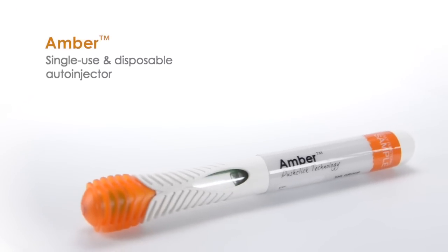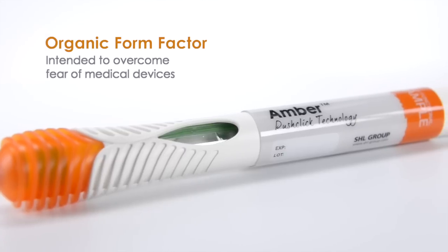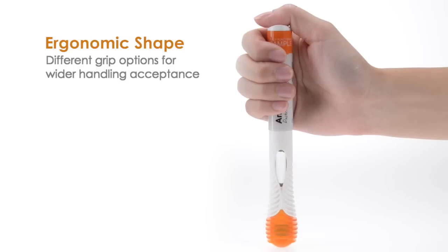Amber is a single-use disposable auto-injector. The organic form factor is intended to overcome the fear of medical devices, and the ergonomic shape provides different grip options for the user to meet a wider handling acceptance.